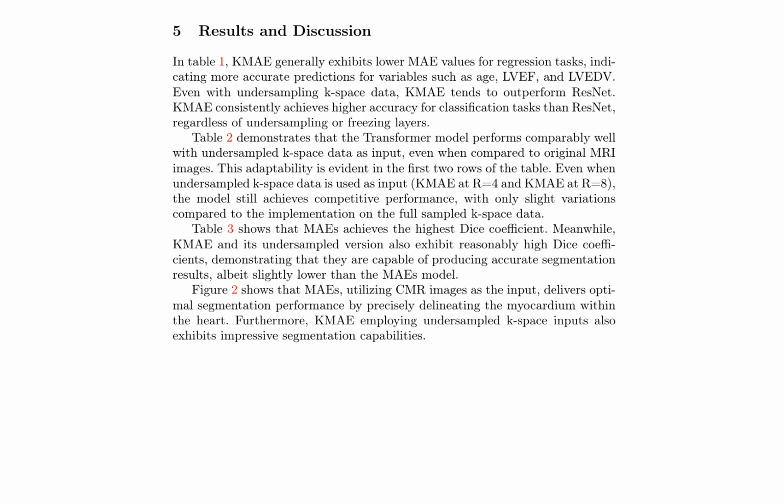Table 3 shows that MAE achieves the highest dice coefficient, indicating optimal segmentation performance. KMAE and its undersampled version also exhibit reasonably high dice coefficients, demonstrating accurate segmentation results. Figure 2 illustrates MAE's optimal segmentation performance by precisely delineating the myocardium within the heart. KMAE employing undersampled K-space inputs also exhibits impressive segmentation capabilities.